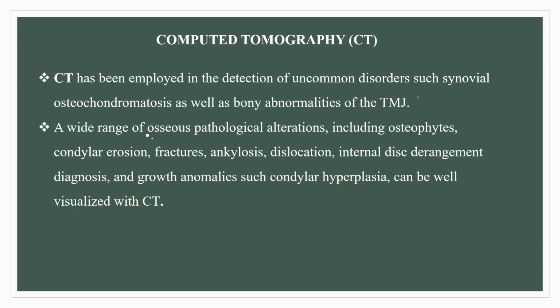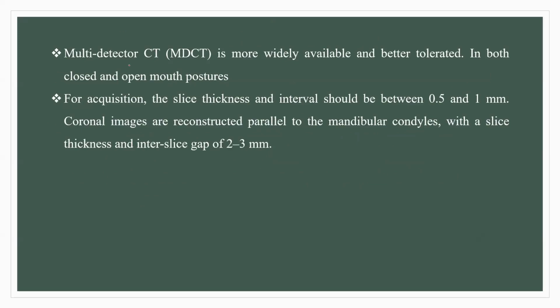Coming to computer tomography, it has been employed in the detection of uncommon disorders such as synovial osteochondromatosis as well as bony abnormalities of the TMJ. A wide range of osseous pathological alterations, including osteophytes, condylar erosions, fractures, ankylosis, dislocation, internal disc derangements, and growth anomalies like condylar hyperplasia, etc., can be visualized with computer tomography. Multi-detector CT, MDCT, is more widely available and better tolerated, and the slice thickness and interval should be between 0.5 to 1 mm.